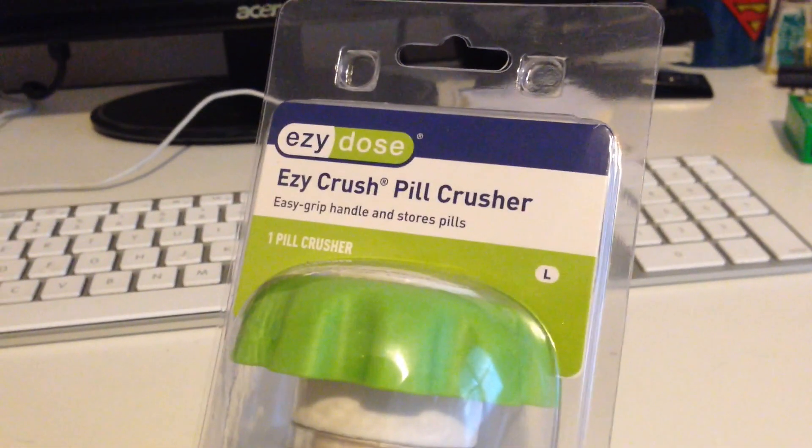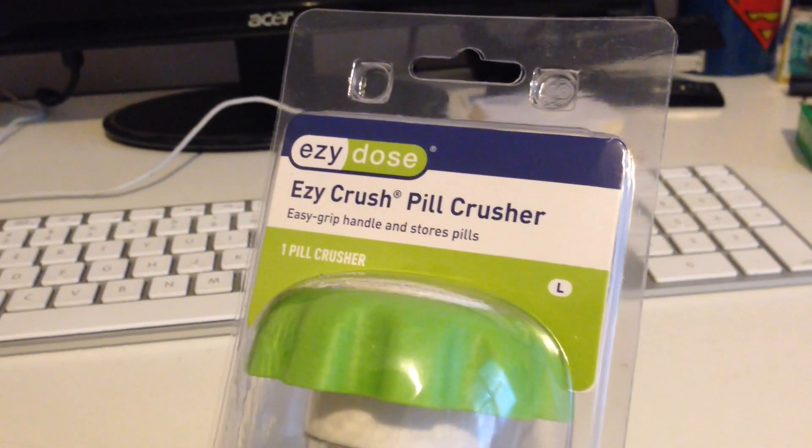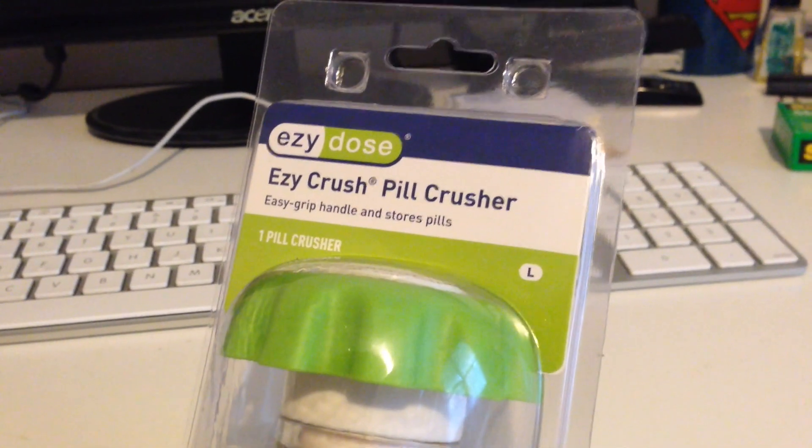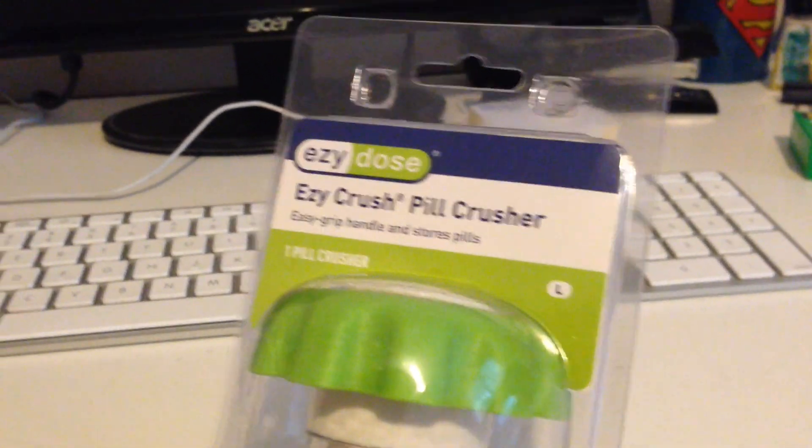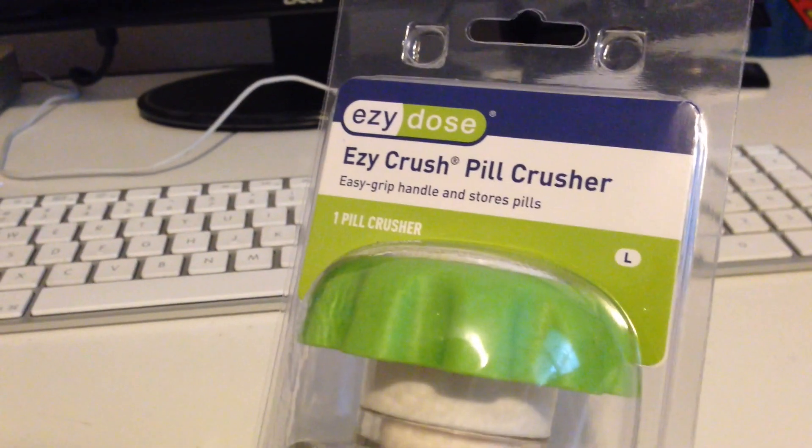I take medication for high blood pressure and a lot of the pills that I take are sometimes a little too big for me to swallow. Like here's an example right here.